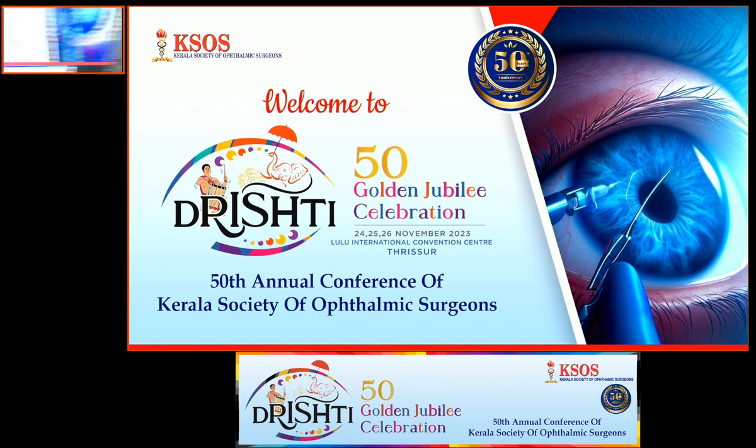Was there any situation in all these 3 cases you have placed the lens in the sulcus? Was there any situation in any other case where you have placed it in the bag? Yes, if the posterior capsular rhexis is ideal, as you are planning it, normally we place it in the bag. So here in these cases, in the second case, there was a very large posterior capsular deficiency which was pre-existing. So I had to convert it into a larger one. So putting it in the bag was totally out of question.